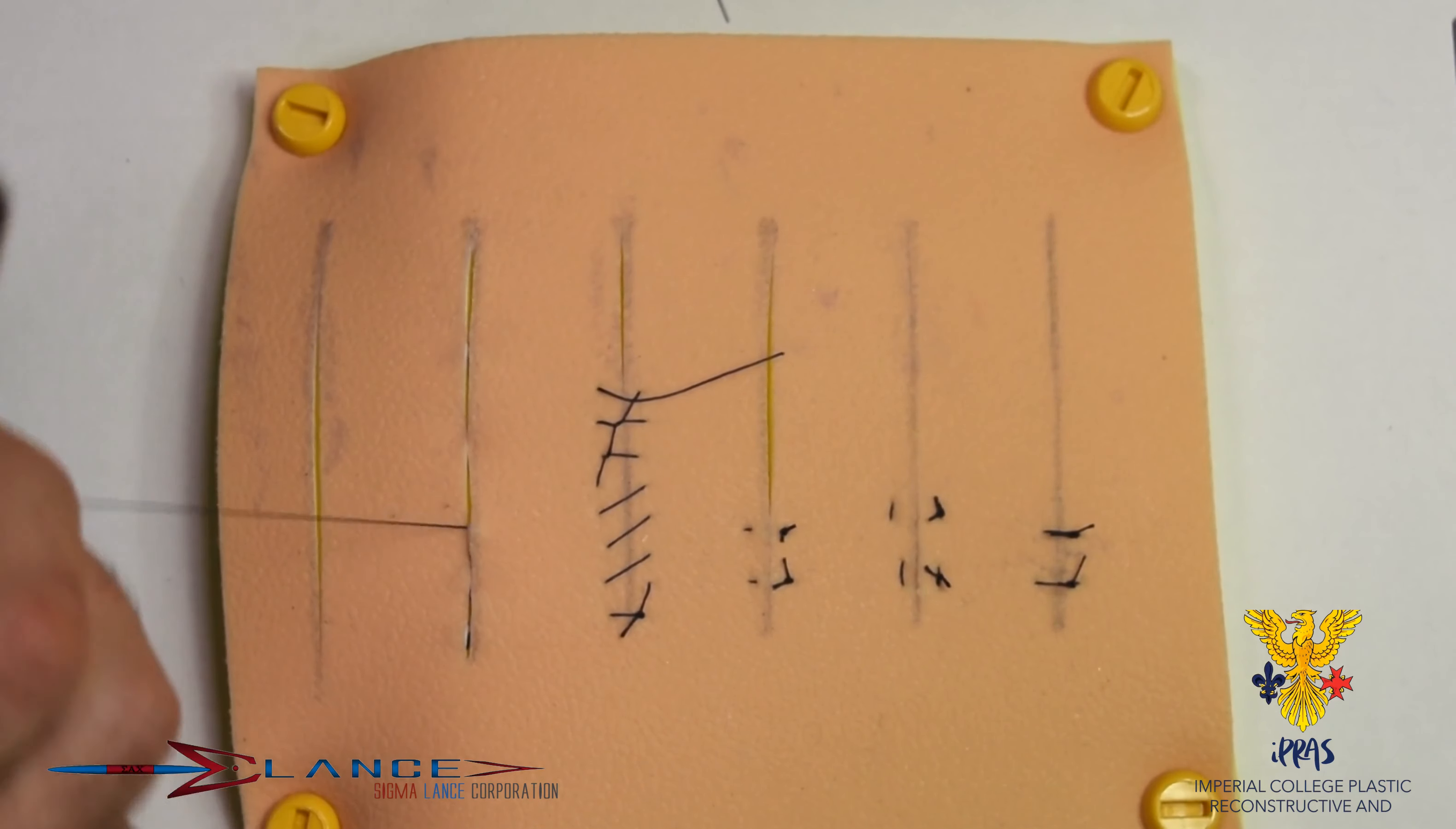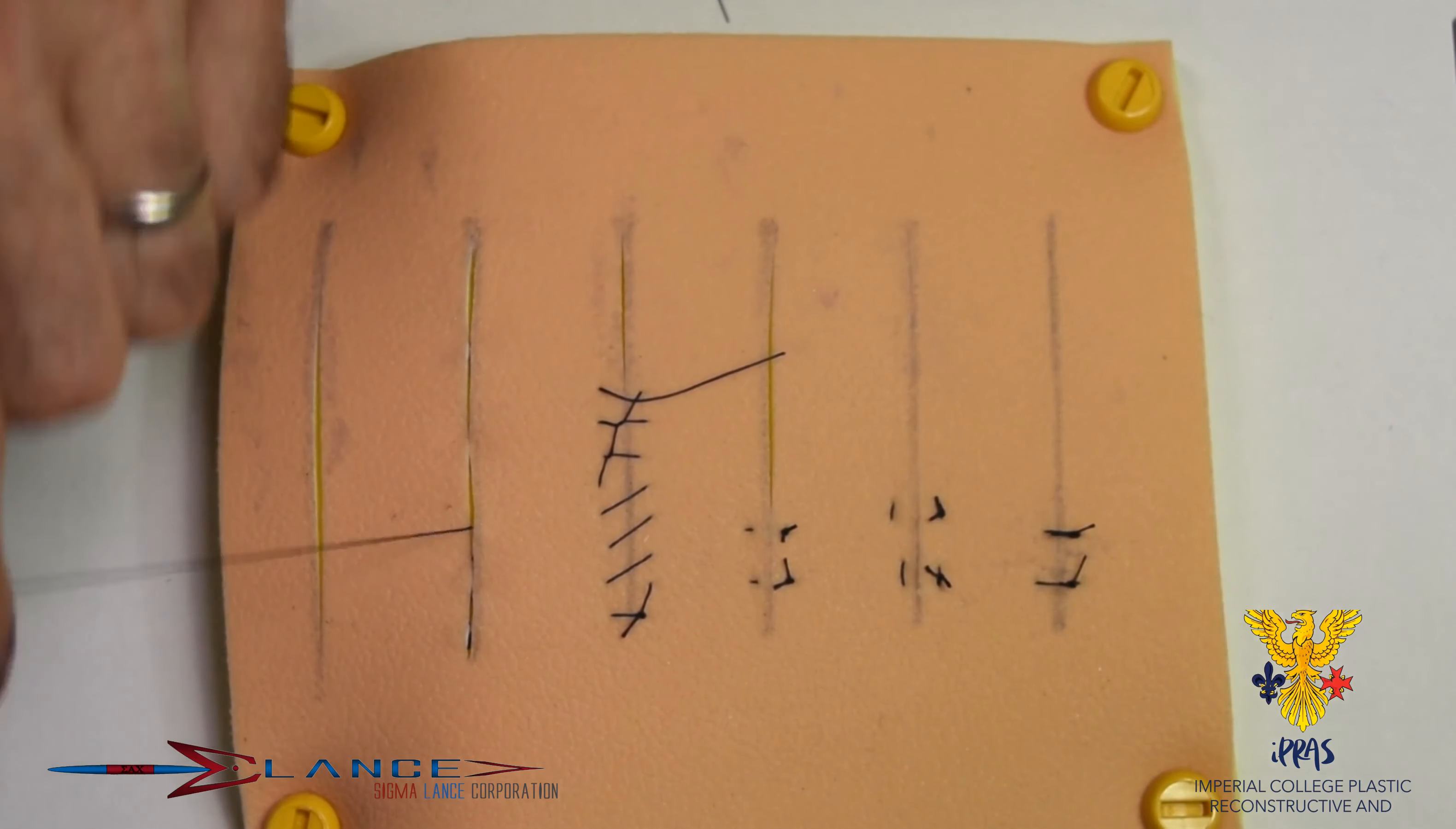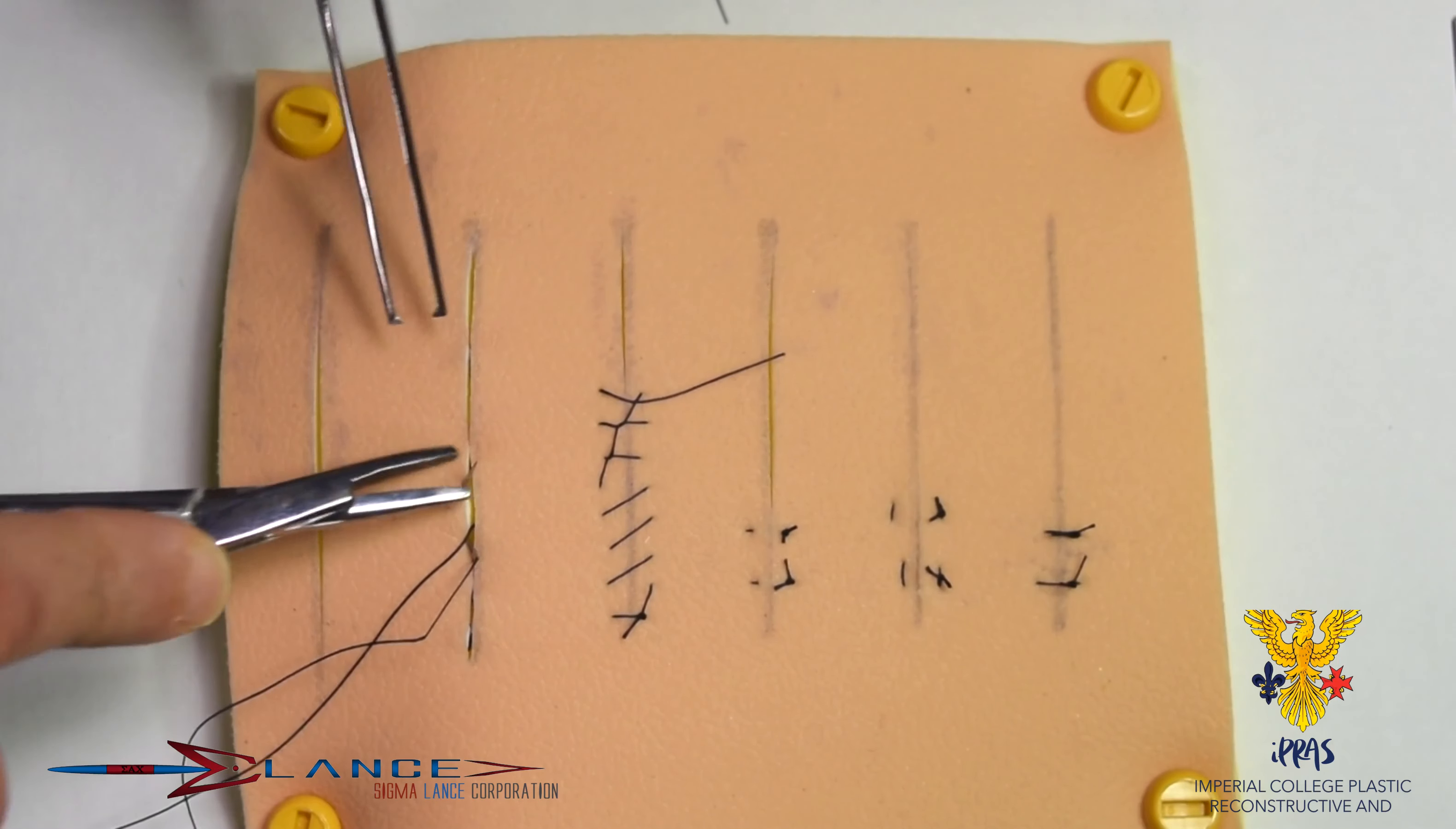And I've caught a little bit in front, trying not to demonstrate that, and you can see the skin hasn't closed very well. So the next bite, I need to go back, and here I need to start behind where that's coming out, and that's a much better bite.